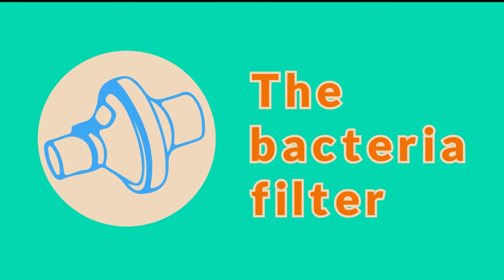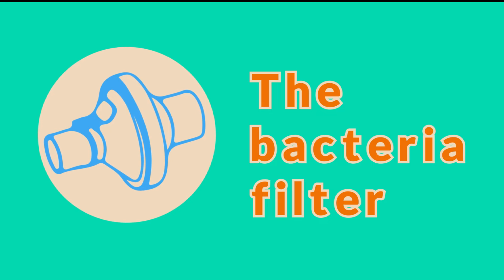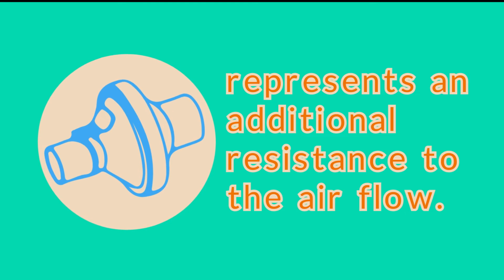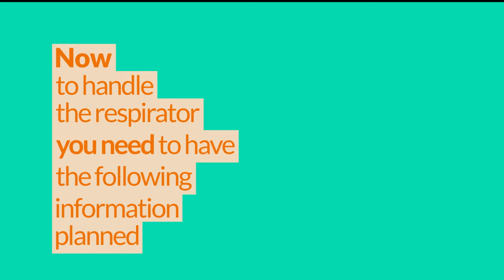If the device is intended for use by several patients, for example in a hospital, your doctor must use bacteria filter WM24148 to prevent infection. It is plugged between the tube system and Ventimotion 2 VentiClick. The bacteria filter represents an additional resistance to airflow. This may affect a change in trigger response characteristics, so have the device parameters reset if a bacteria filter is fitted retrospectively. Now, to handle the respirator, you need to have the following information planned.